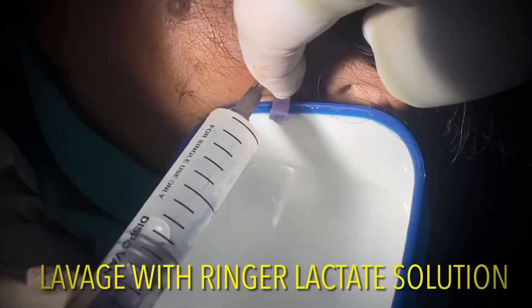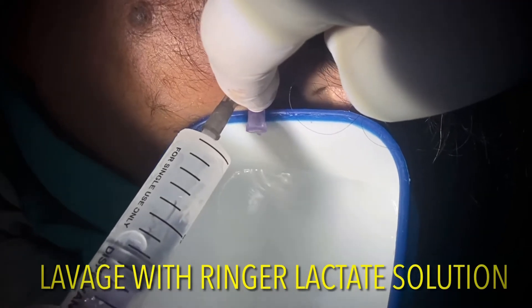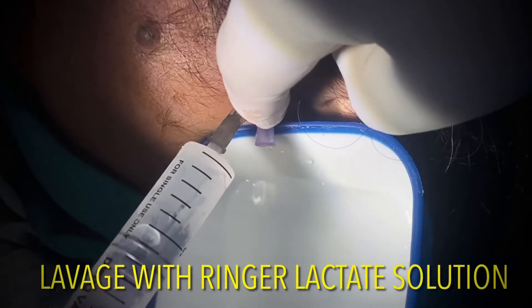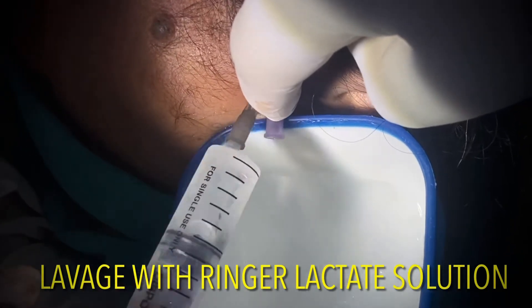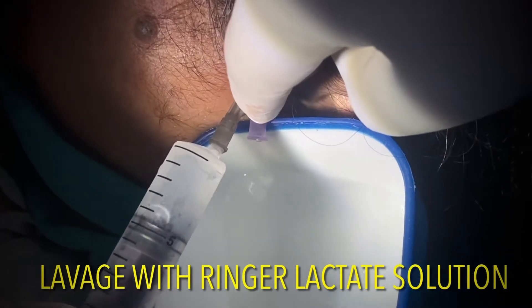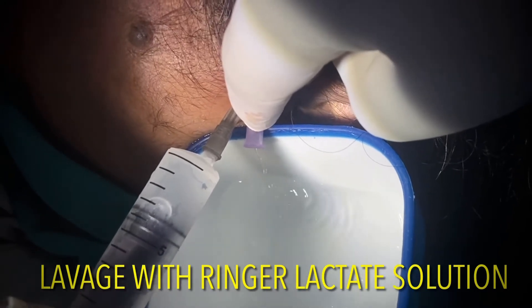In this particular case a total of 150 ml of Ringer's lactate solution was used to lavage the joint, followed by a long-acting steroids injection inside and around the joint. This steroid works as an anti-inflammatory and further reduces the pain.